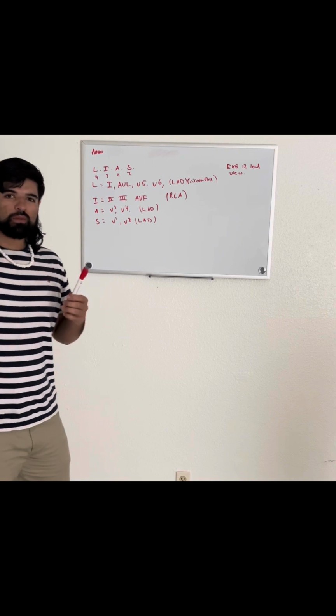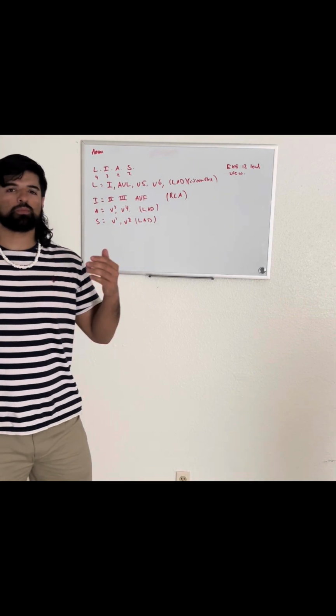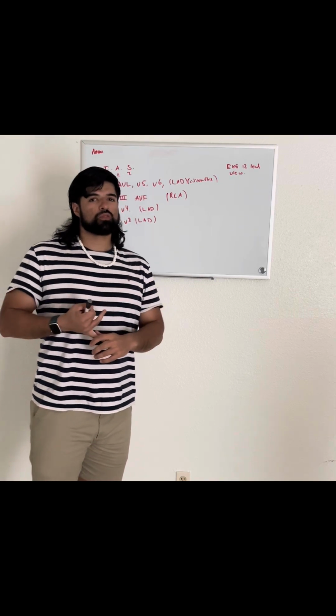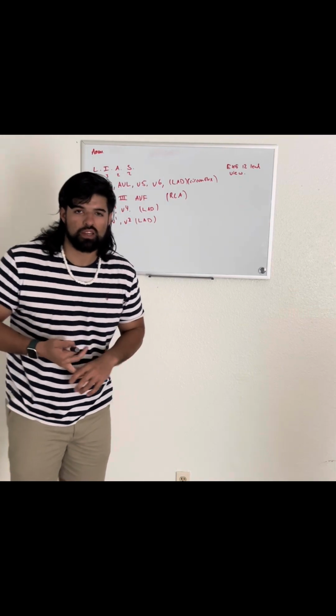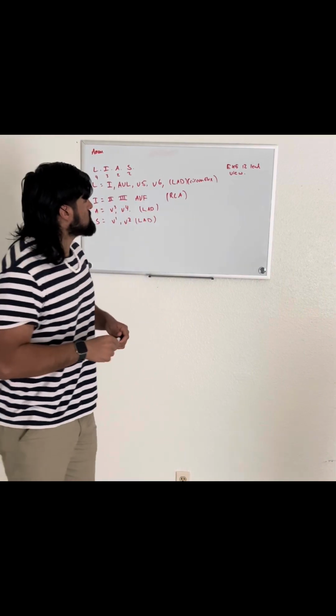So I came up with this mnemonic, so hopefully it can help you guys, people who are getting their EKG certification, taking their CCT or their CRAT. Hopefully this can help. It helped me. So let's break it down.